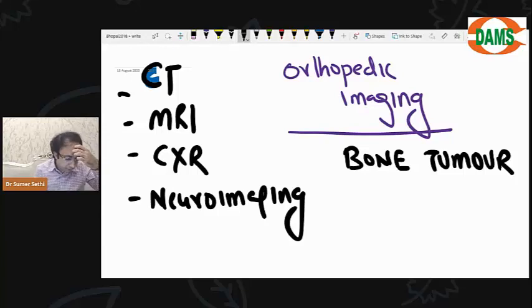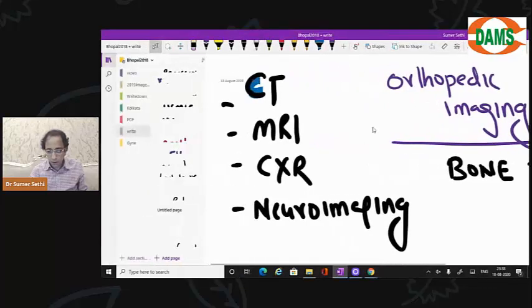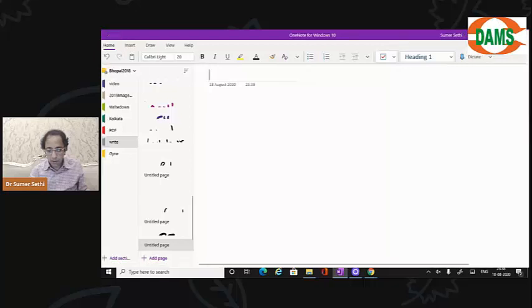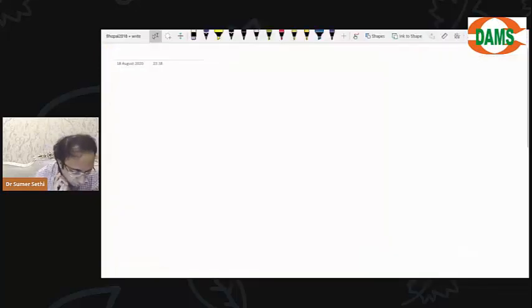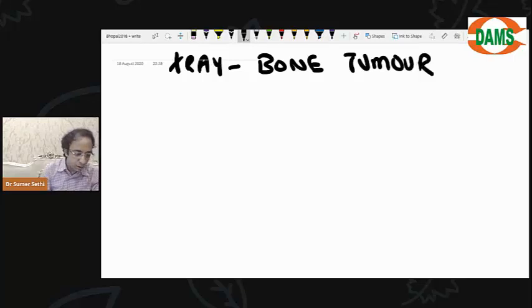Okay, everybody? Okay, we'll talk about bone tumors. Now let's see if you can answer. Let's see if you can answer better. So first of all, I will only tell you the basic concept behind an X-ray approach to a bone tumor, and then we will see practically. Okay, beta. I will first show you the basic approach, then I will show you practically. Some of you might have studied this before, but let's see if you can answer.